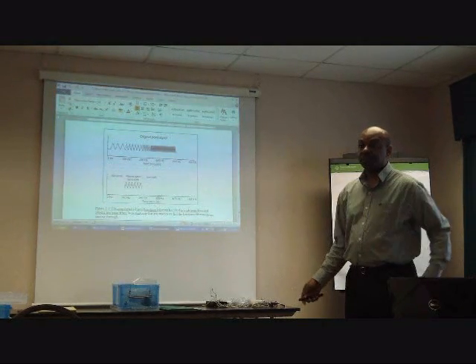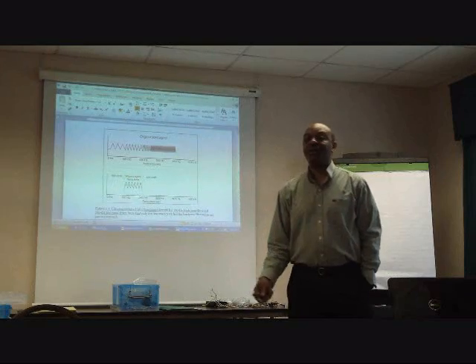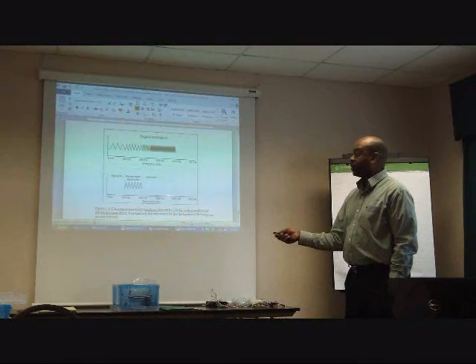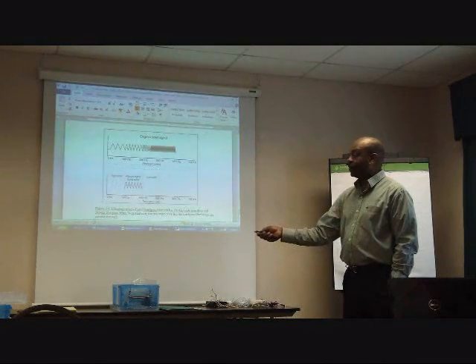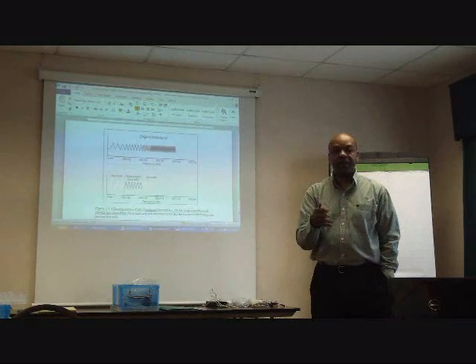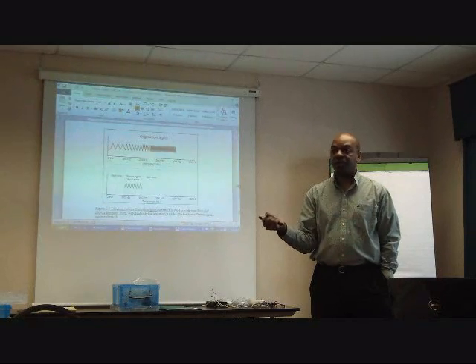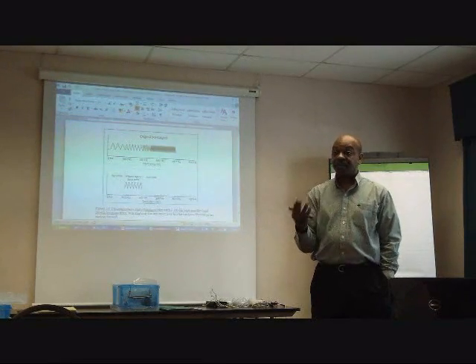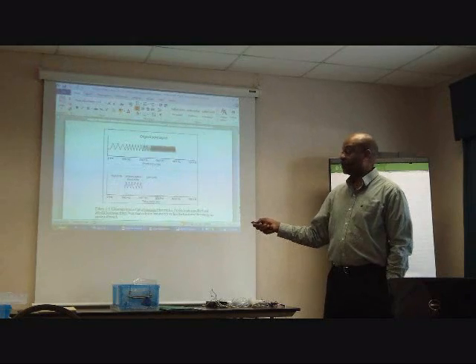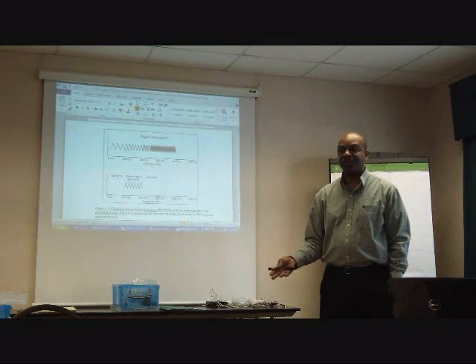So if that's a narrow band, why would we ever want a wide band? Good question. We would want a wide band in some cases because there may be some situations where there's muscle activity going on over here, and if we use this frequency band, we wouldn't see it. Like for instance, we would go back to the pelvic muscle disorder. If we're using a vaginal sensor and we're asking the person to do Kegels and measuring the activity there, and they're contracting the muscle, but most of the activity is over here, and I'm using this filter, I'm going to say, no, you're not contracting the muscle, and keep telling them that they have to do something different.